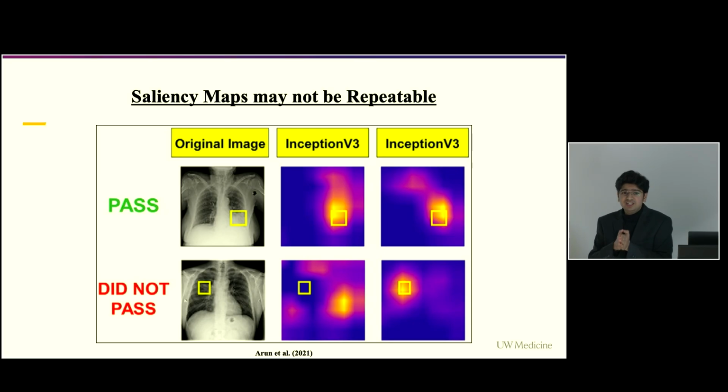You can potentially use these saliency maps to fool a clinician, to fool a radiologist, into thinking that our model is not only doing an amazing job, but is also interpretable. It is like training to become a radiologist, and then you see that there are these cases where it just does not work really well.